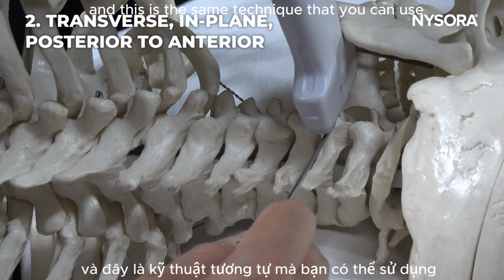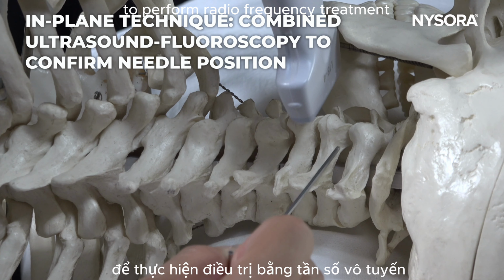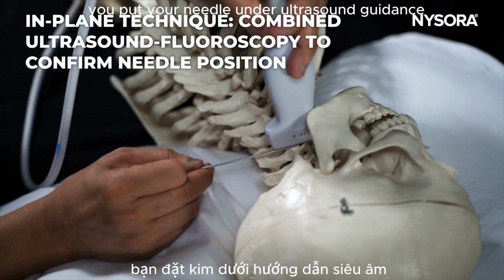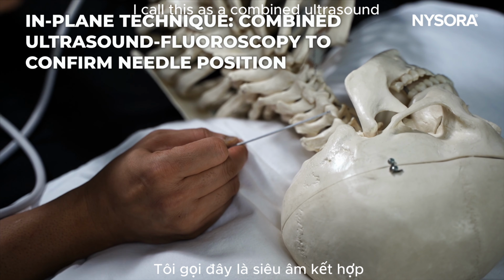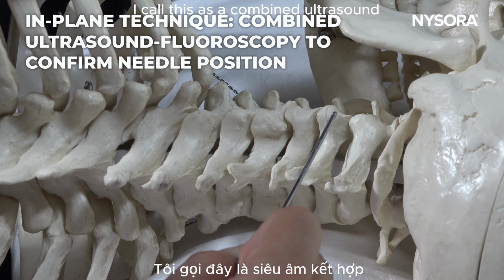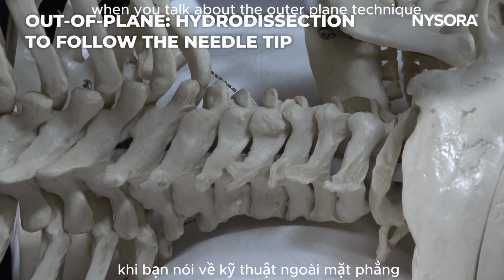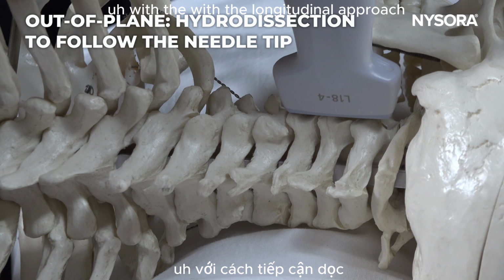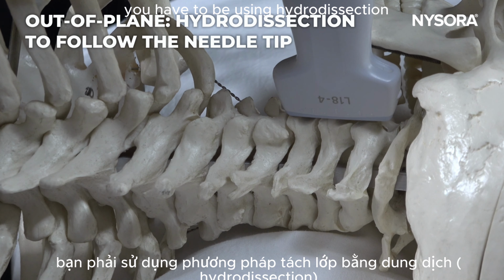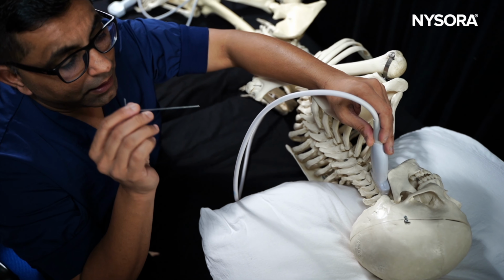And this is the same technique that you can use to perform radiofrequency treatment. So you do an in-plane technique, you put your needle under ultrasound guidance, and then you do an X-ray. I call this a combined ultrasound fluoroscopy technique, or CUFF technique. When you talk about the out-of-plane technique with the longitudinal approach, you have to use hydrodissection to make sure you chase your needle tip.